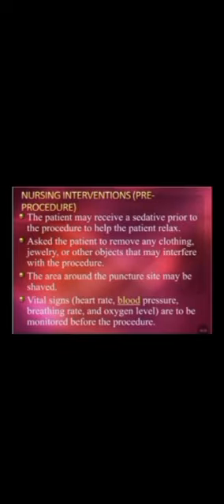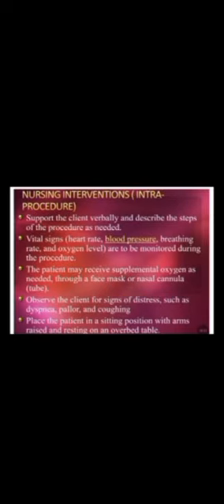The patients may receive a sedative prior to the procedure to help them relax. Ask the patient to remove any clothing, jewelry or other objects that may interfere with the procedure. The area around the puncture site may be shaved. Vital signs: heart rate, blood pressure, breathing rate, and oxygen level are to be monitored before the procedure. Support the client verbally and describe the steps of the procedure as needed.